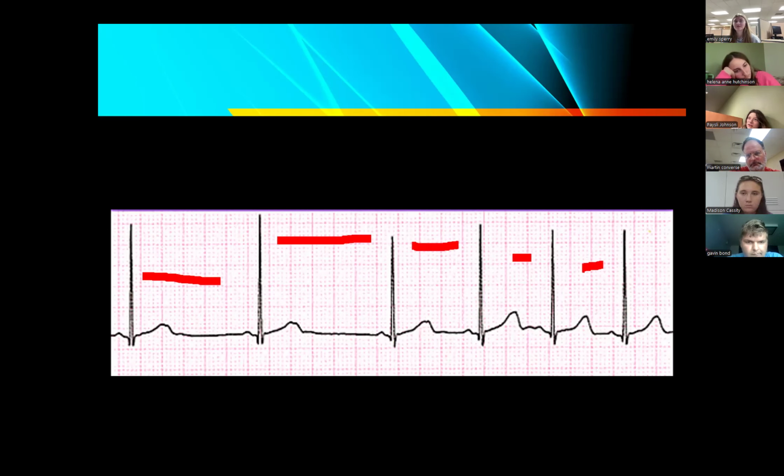Some of them do. Okay. Which one do you feel like looks different? This would be QRS 1 all the way through. So tell me which one you would feel looks different. Like the fourth one? Well, no, fifth one. Yeah. Fifth one. Okay, good. So, yes, this one does look a little bit different, and the reason is because the rate is increasing.